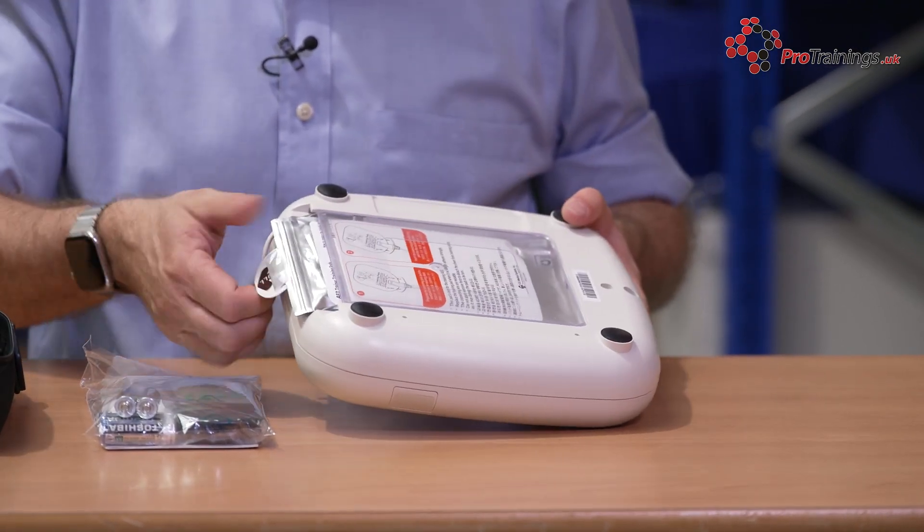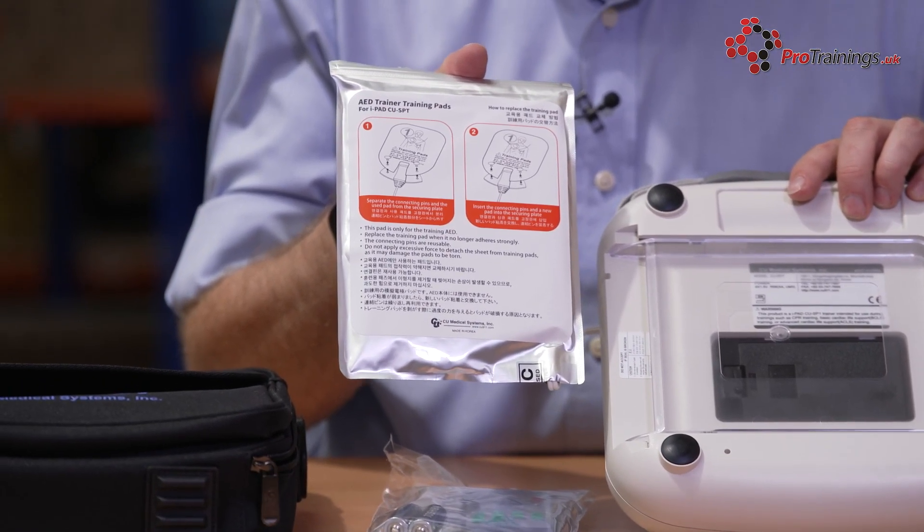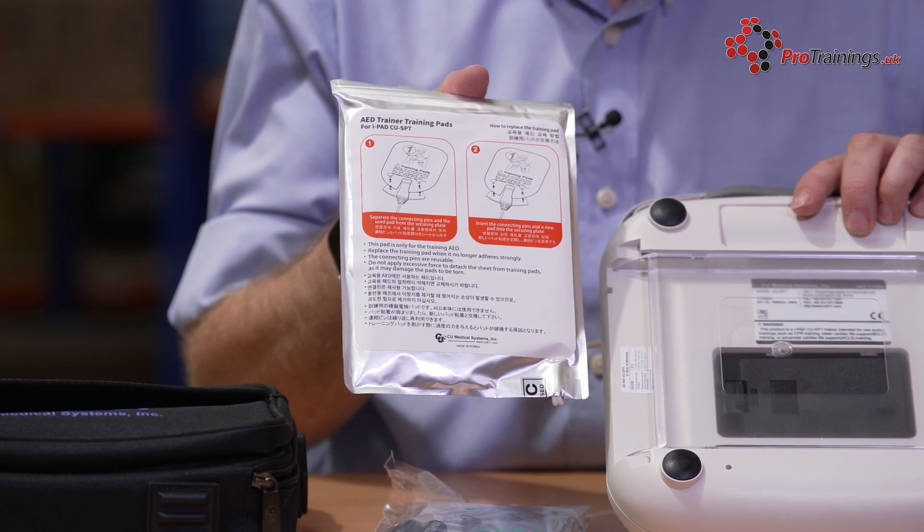On the back of the unit, you have the pad cartridge itself, which you can just pull out. Here are your standard pads — as they're training ones, you can just reseal them back into the pack and then pop them back in place.